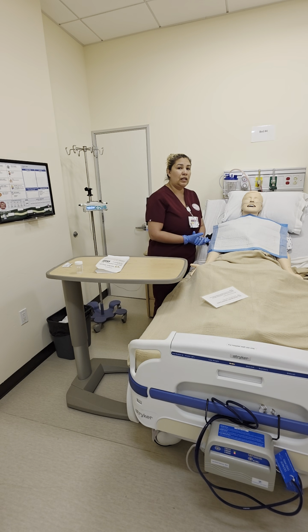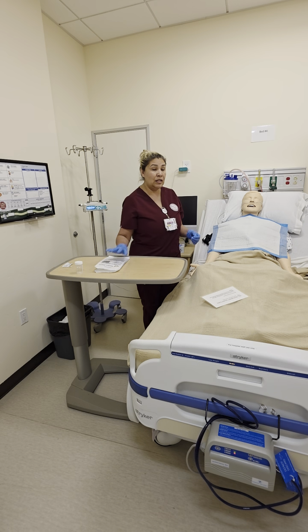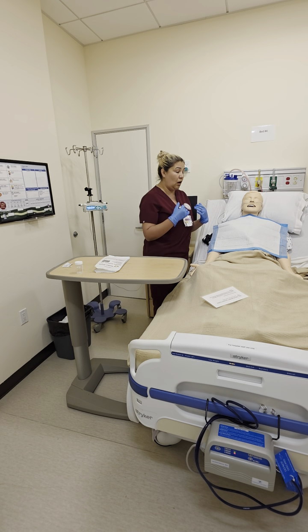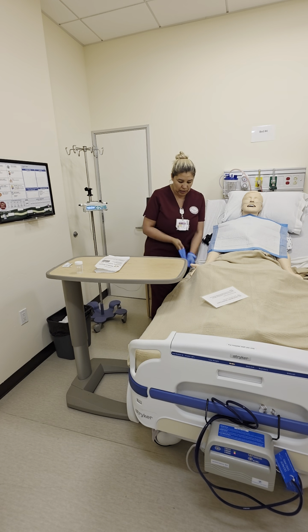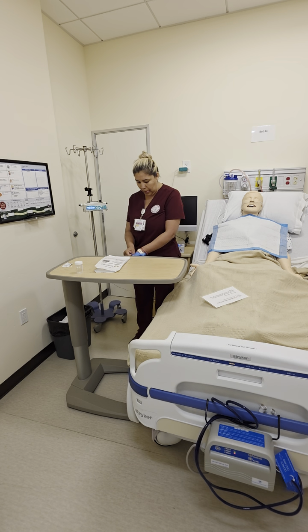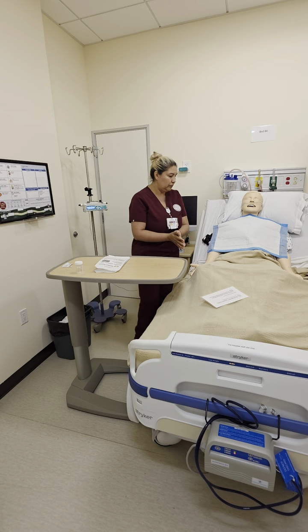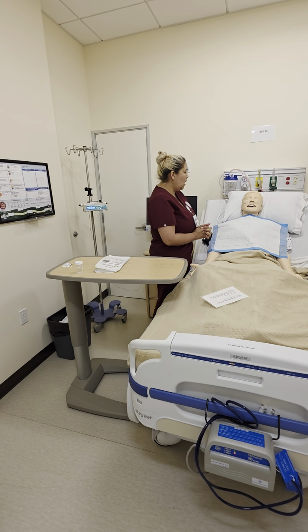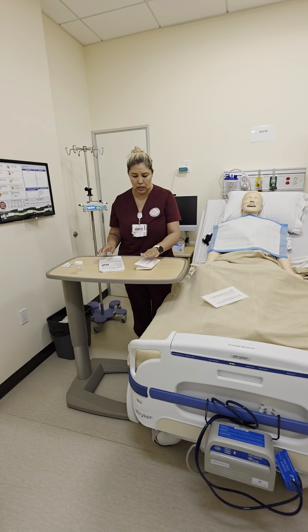I did find that there is a need for me to perform the suction, because his airway is not clearing due to all that gunk in there. Okay, so I will go ahead and get started, removing these gloves, performing hand hygiene, and again asking my patient if there are any questions. My patient said no, so I'm going to get started.